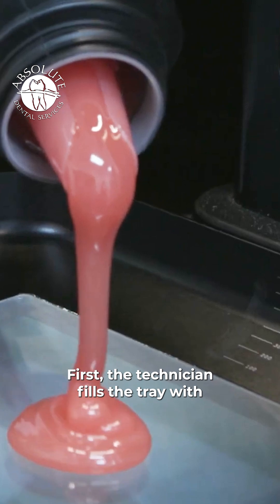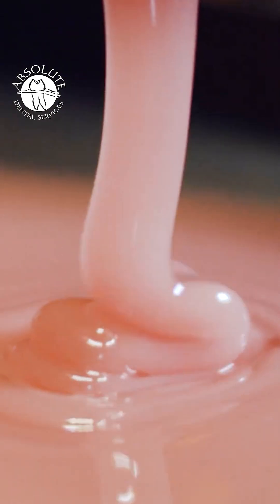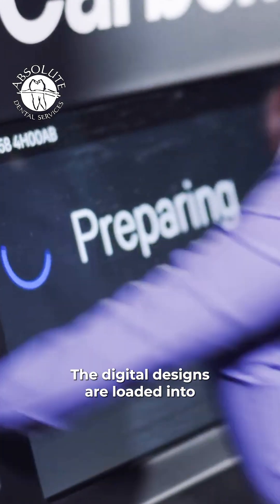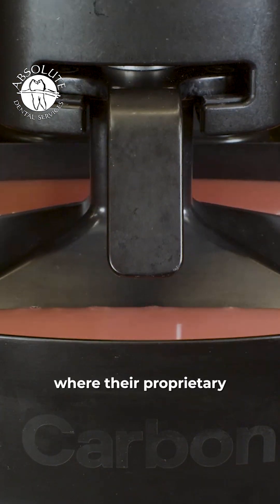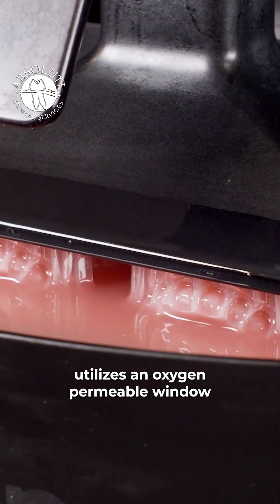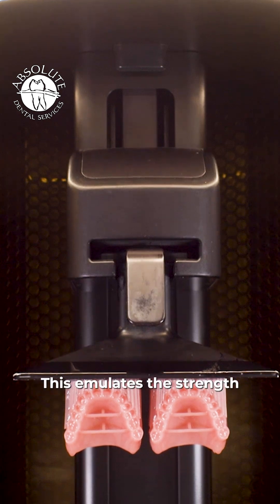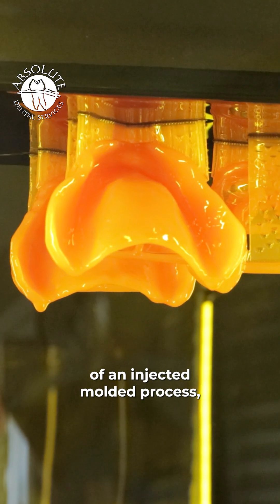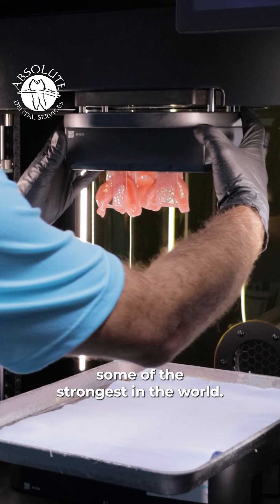First, the technician fills the tray with the appropriate Lusitone digital print material. The digital designs are loaded into carbon printing machines where their proprietary digital light synthesis printing method utilizes an oxygen permeable window that allows the system to print in a continuous motion. This emulates the strength of an injection molded process, making our dentures some of the strongest in the world.